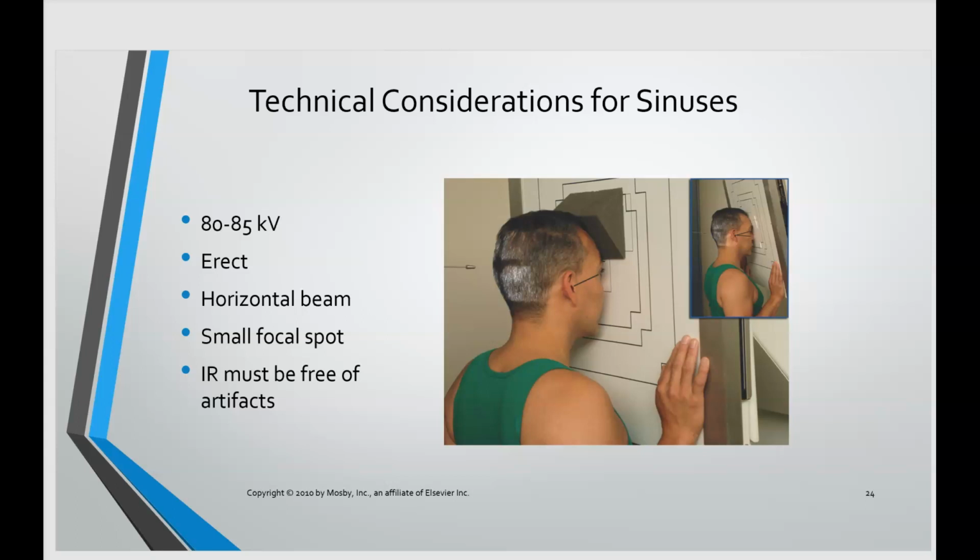And your IRs in these pictures need to be free of artifacts. So make sure your IR screens are clean. Like we were talking about during orbit imaging, how important it is not to have any flecks of anything on your screen and to make sure your IRs are cleaned. Okay, we're going to do the same here for sinuses.